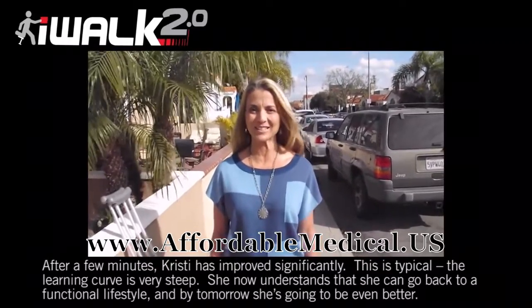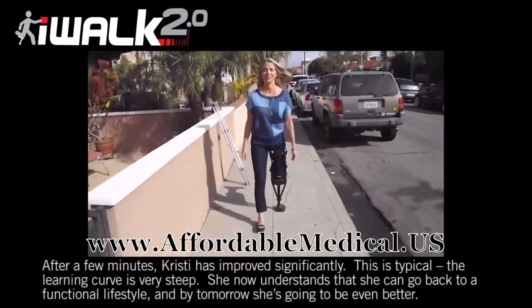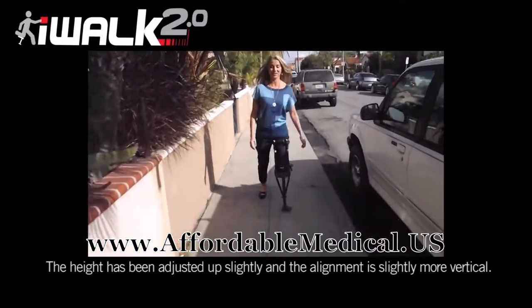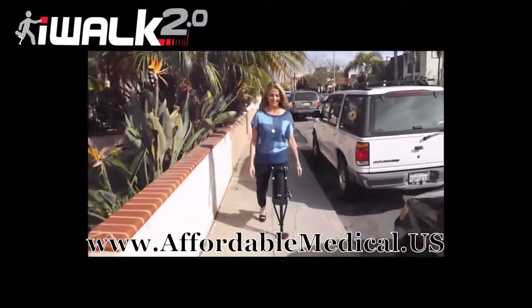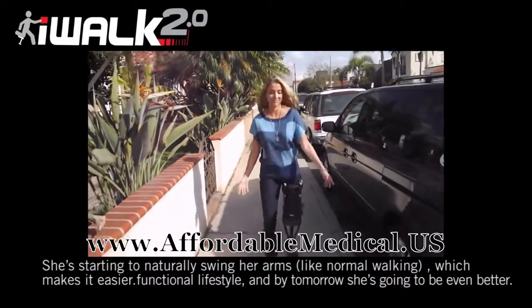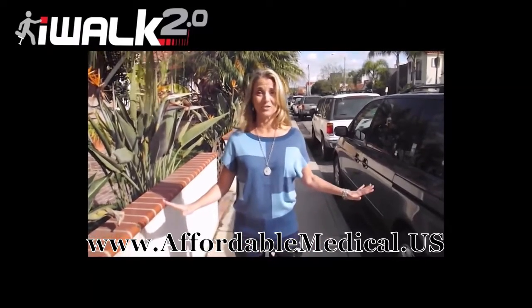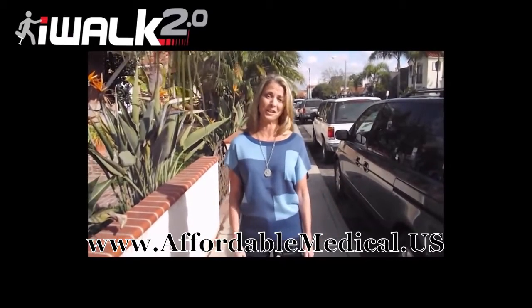It's me again. I've been practicing for a few minutes and I'm ready to show you what I can do now. It feels pretty natural. I feel pretty comfortable. It's a lot easier than I would have thought. I think pretty much anybody could do this. It's comfortable. It's great. So if you're on crutches, ditch the crutches, get the iWalk. It's going to be life-changing for me. I cannot wait to go home and cook dinner, go to my work meeting, and do my presentation. So, thank you so much.